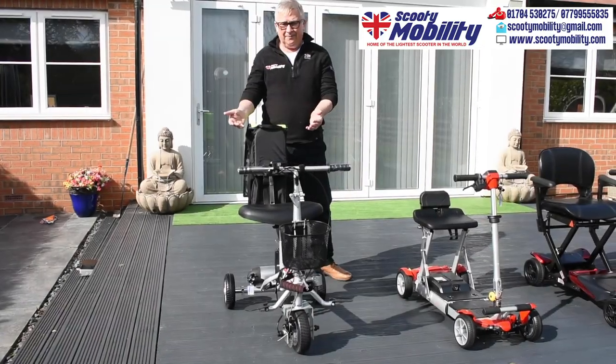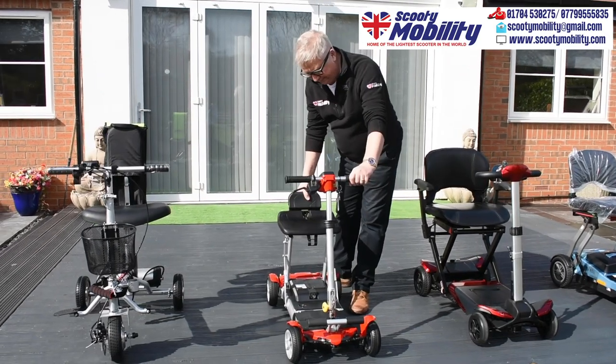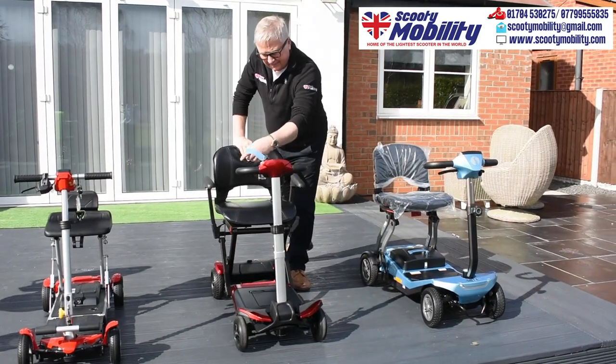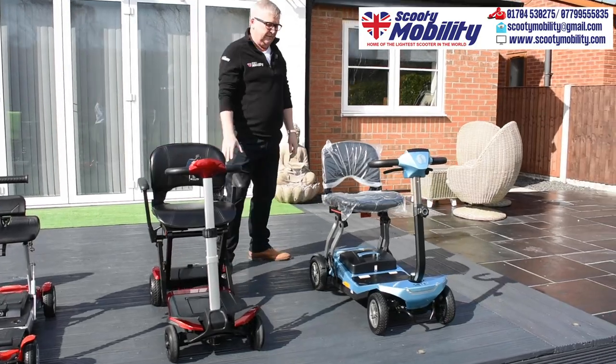This is the Scooty, and this is our newest model, the Superlite, and our Auto Fold, and our new Super Deluxe.